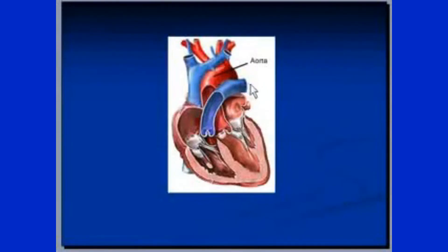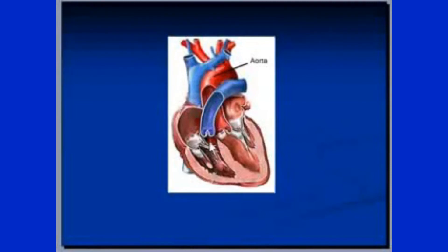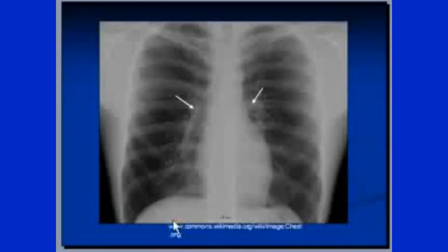The pulmonary artery divides into the left and right pulmonary arteries from behind, taking deoxygenated blood from the right ventricle to the lungs. Both pulmonary arteries are visible here — this is the right pulmonary artery and this is the left pulmonary artery.